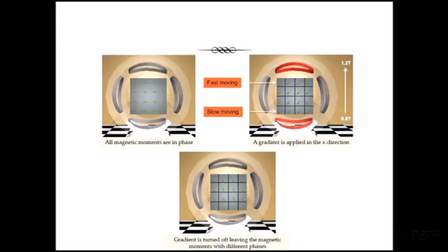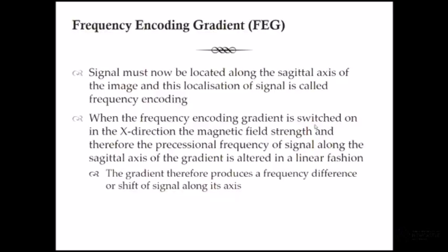That frequency will then tell us where their spatial location is within this very coarse matrix that we've used here. So that's a matrix 4x4. When we do this imaging, we might be doing 512 steps times 512 steps. But that is what allows us to work out what's going on, to work out where they come from. So that's phase encoding. We can do the same in the other direction with frequency encoding.